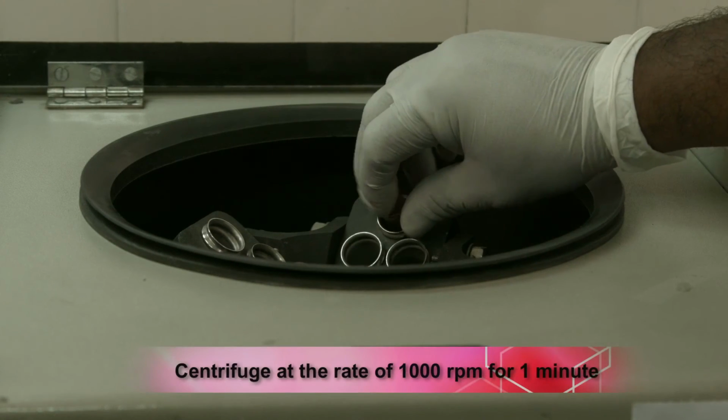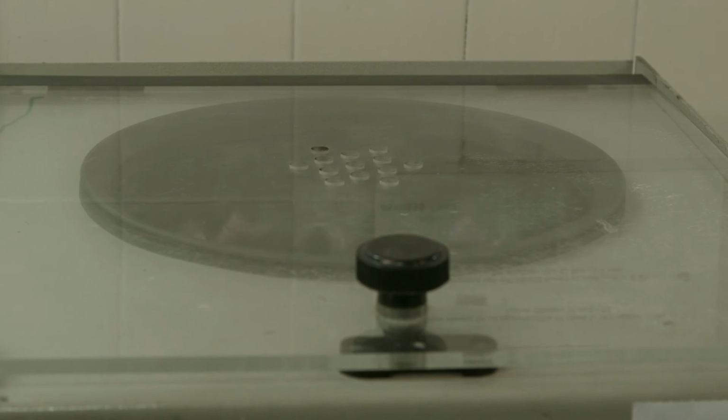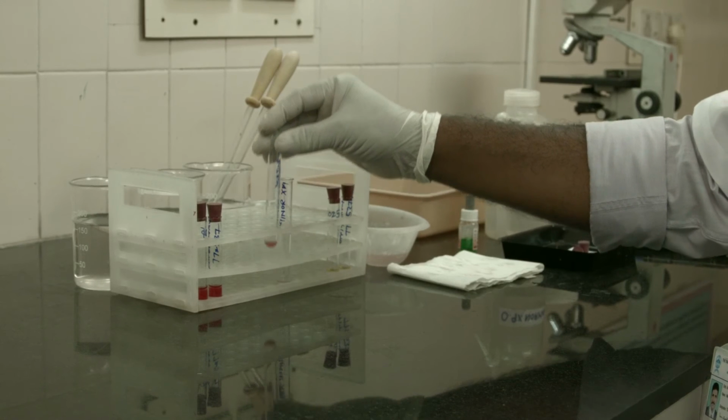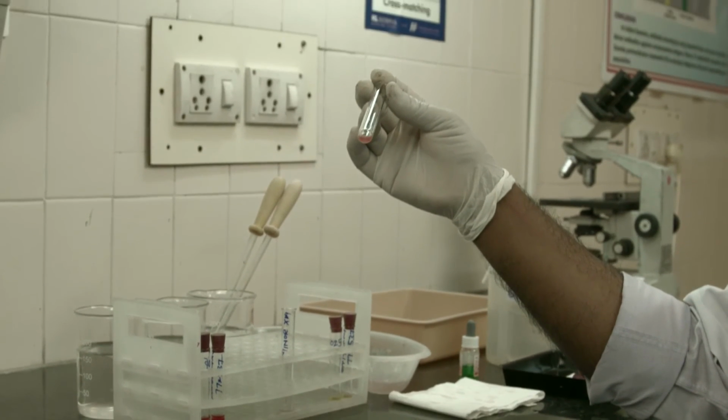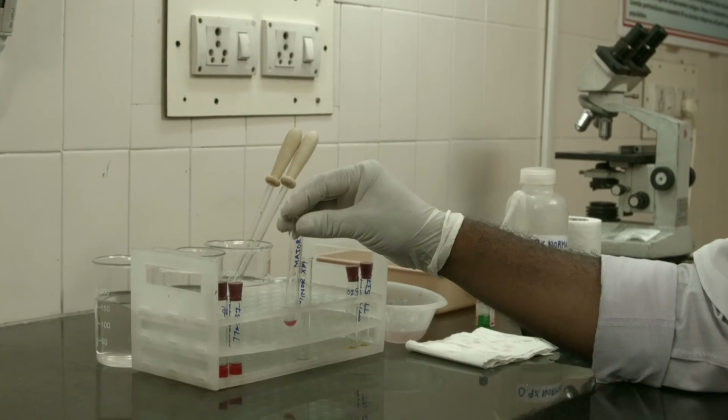Centrifuge at the rate of 1000 rpm for 1 minute. Examine for agglutination or hemolysis after gently resuspending the red cell button.